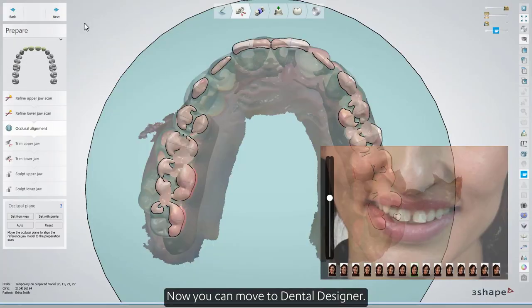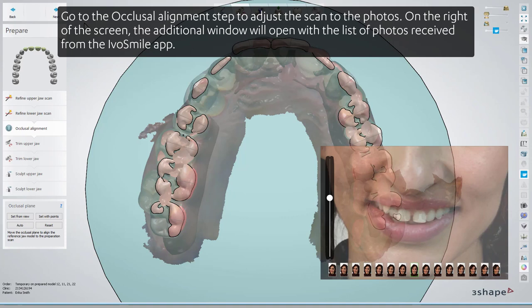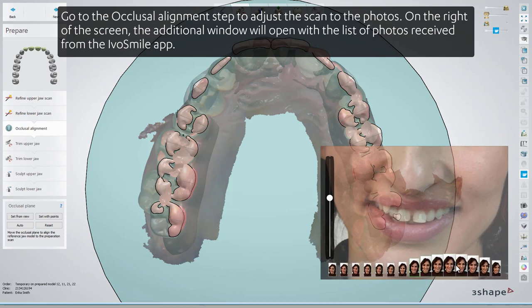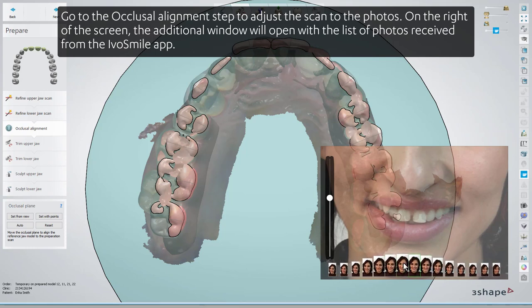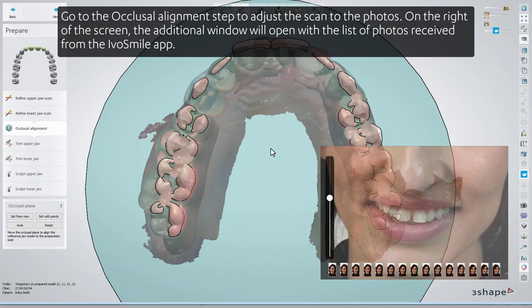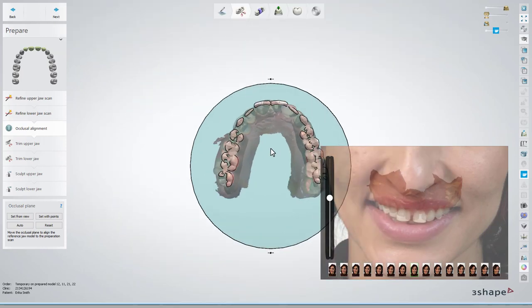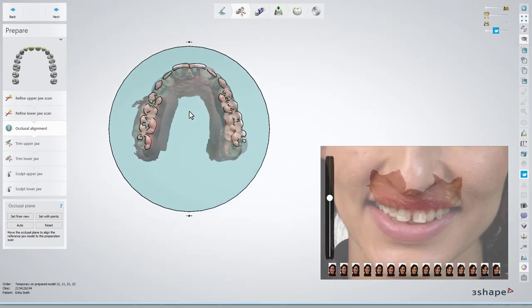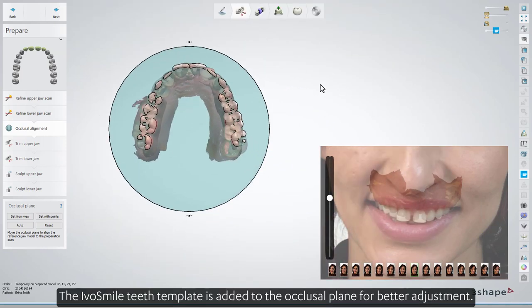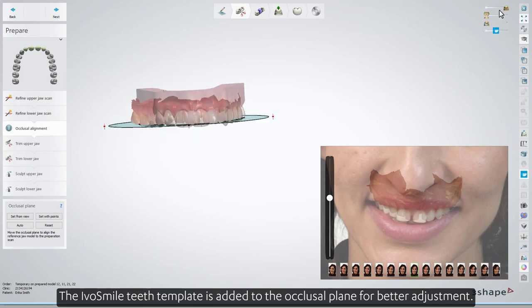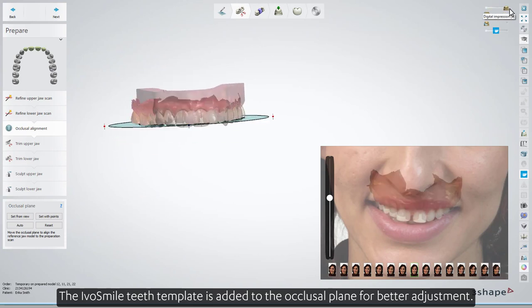Now you can move to Dental Designer. Go to the Occlusal Alignment step to adjust the scans to the photos. On the right of the screen, the additional window will open with the list of photos received from the IvoSmile app. The IvoSmile Teeth template is added to the occlusal plane for better adjustment.